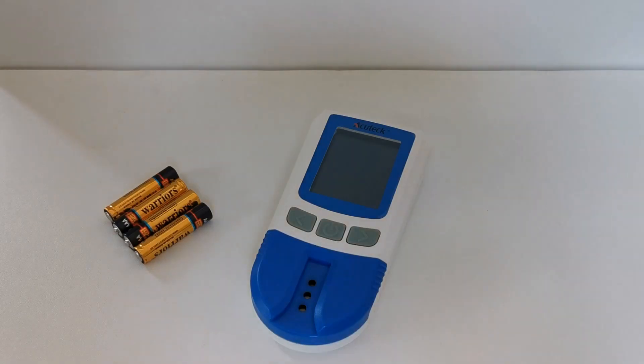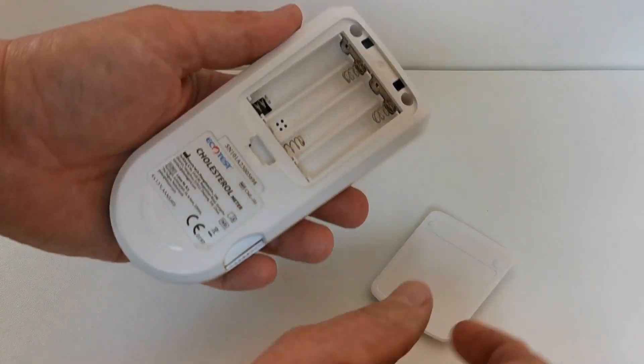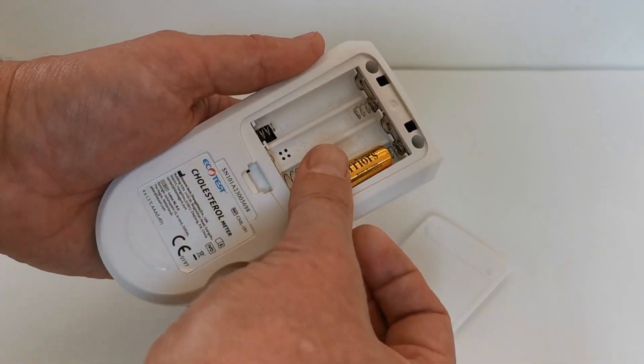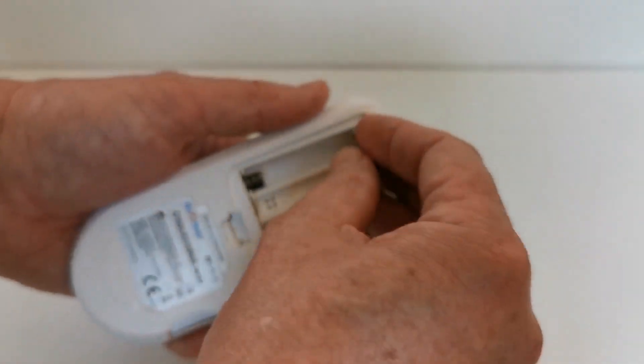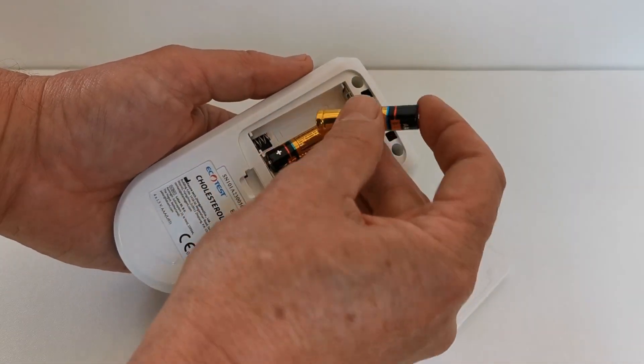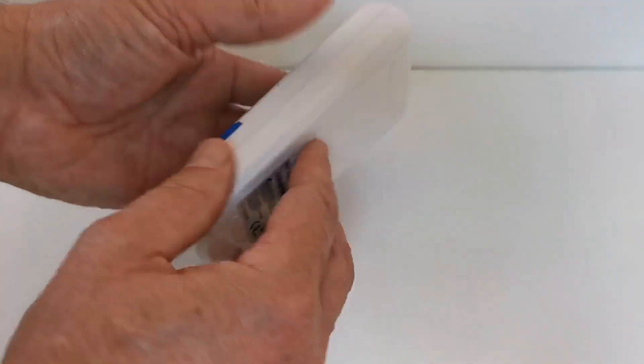We're now going to show you how to insert batteries into the EcoTest meter. Remove the battery compartment cover and, following the diagrams in the base of the battery compartment, fit your four AAA batteries. Then replace the cover.